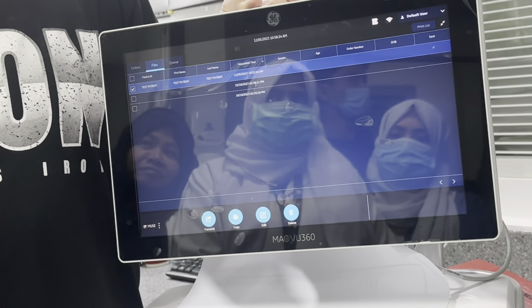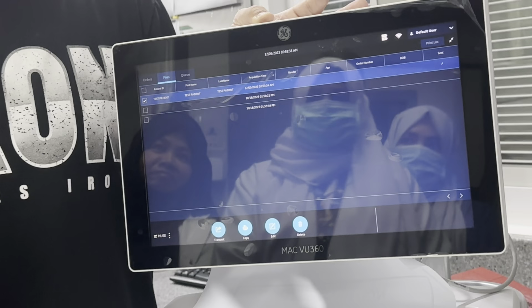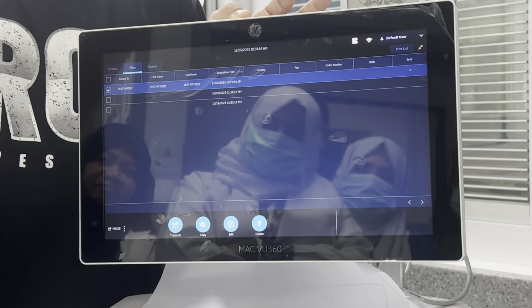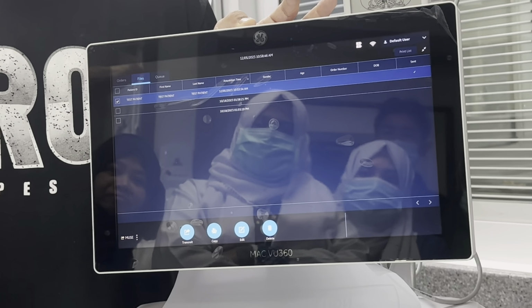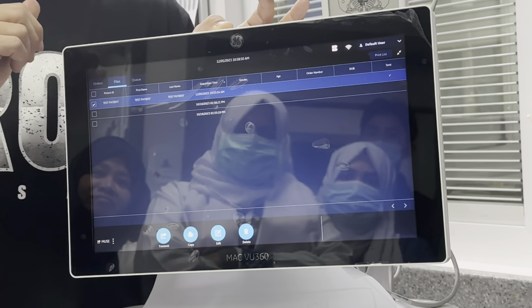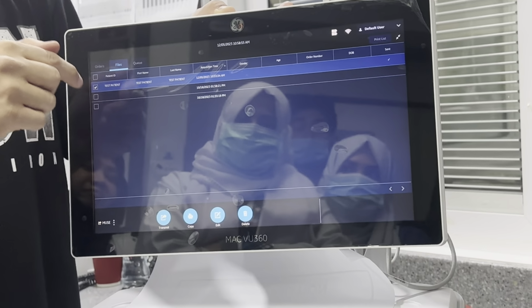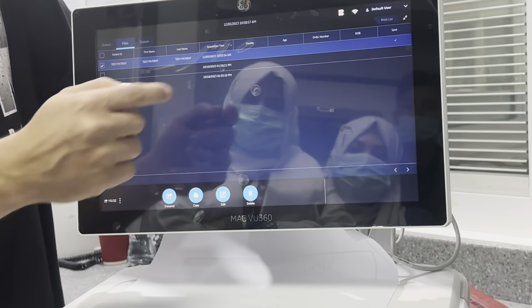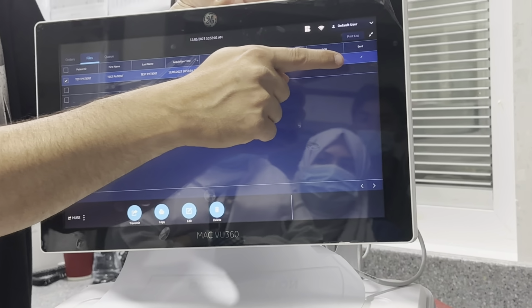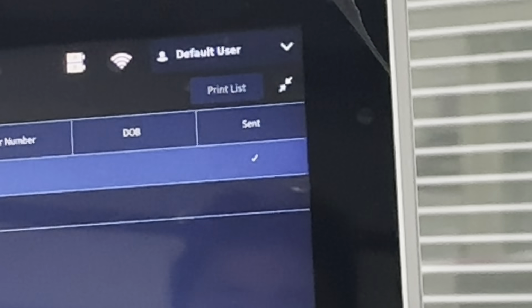So if you are doing 1 ECG daily, let's say after a week you have to schedule that we have to delete this report. So if you didn't delete and you find that alert on the screen, full memory, please do not ignore. You have to go back to the files, delete some reports, then acquire an ECG. Why is that important? Because if I do the save after acquiring the ECG, I want to check the sent status. The sent status is showing up in here when you expand, the check mark. It will tell you that you did transmit that one successfully.